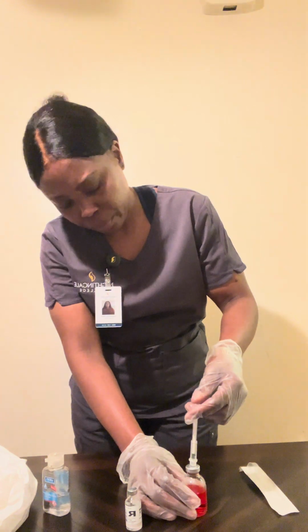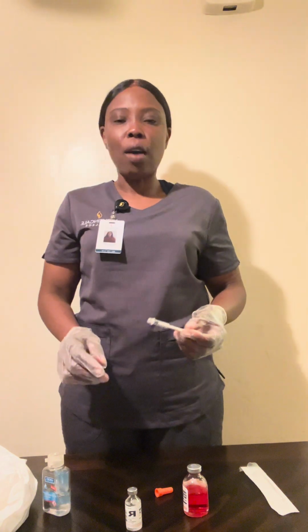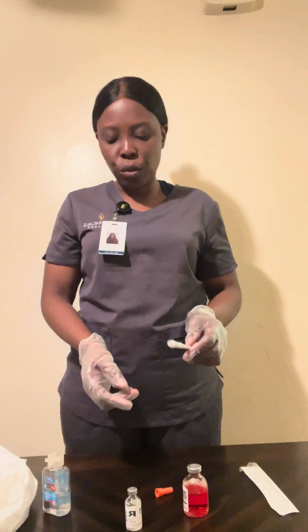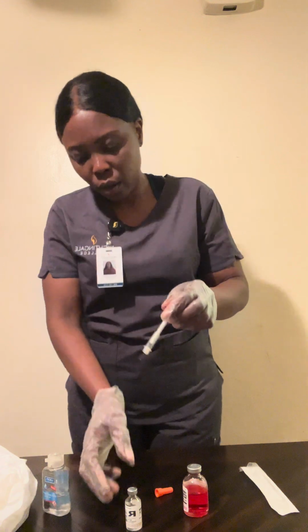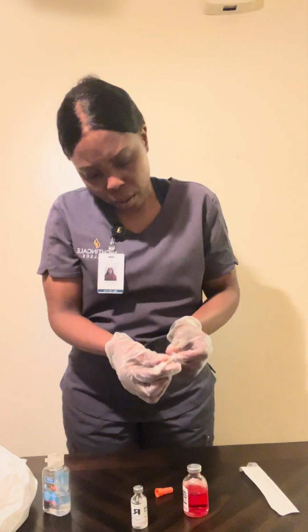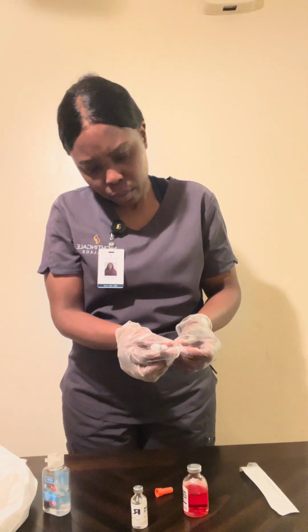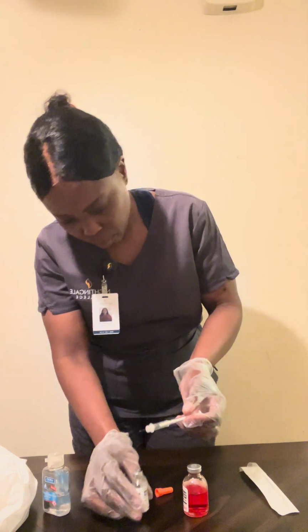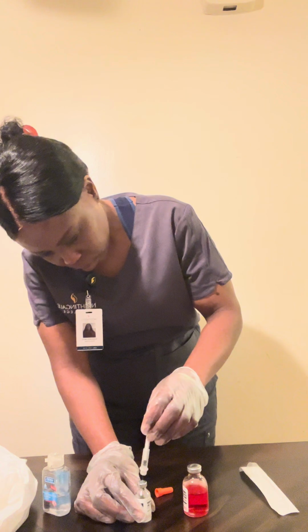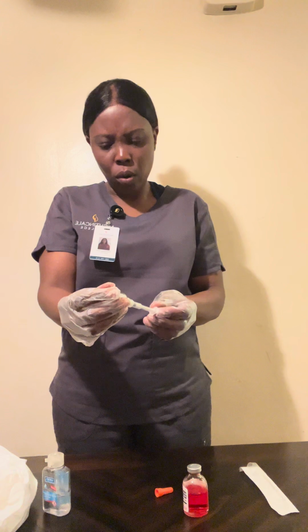At this time I'm not going to withdraw anything. Then I'm going to pull up 4 units of air and inject that into the regular insulin. Now I'm going to withdraw 4 units of regular insulin.